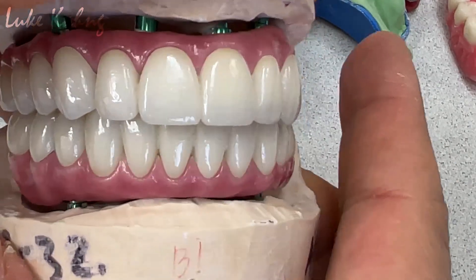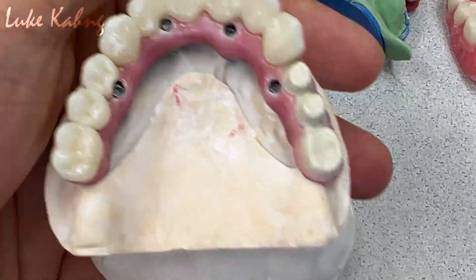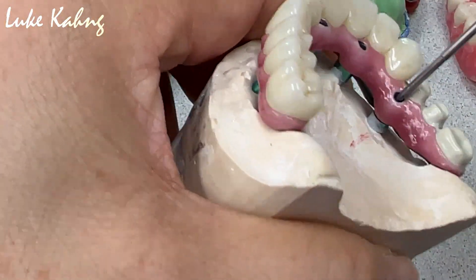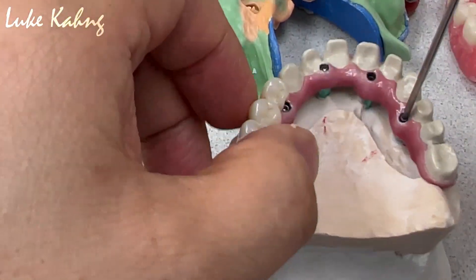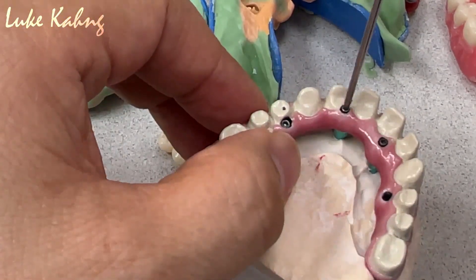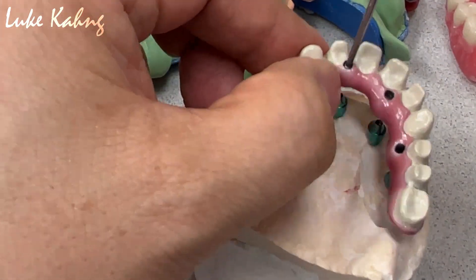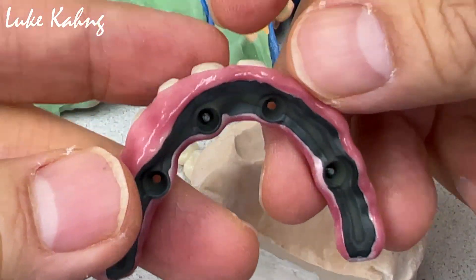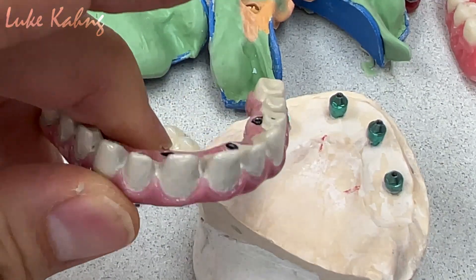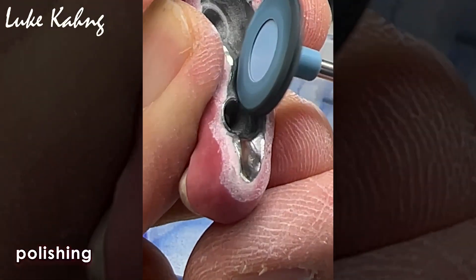This finishes good restorations. So now we can cement. Before we go to cement, you can take it out from underneath. Then we can go to the final polish. Let me show you this. So we're going to polish this really well. I can bring here a little more down. Okay, let's go.